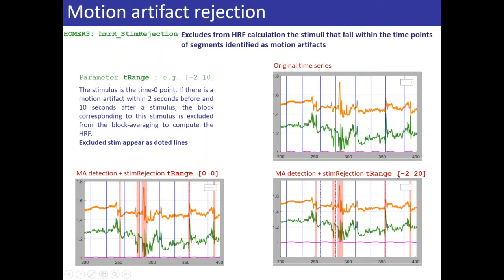Time equals 0 is here, and then we have a motion artifact here, and so it's excluded. If you look here, now we changed the time range from -2 to 20. We have the same motion artifacts, of course. And now many more trials are rejected. So now what it's looking at is, time equals 0 here. It looks at 2 seconds before and 20 seconds after. And of course, we have this huge motion artifact here. And so it excluded this trial, and it is similar with the rest of the trials. So of course, how you define this parameter is, if you expect your HRF to go from 0 to 15, maybe you want to include that much in your tRange.